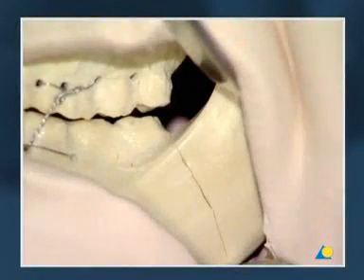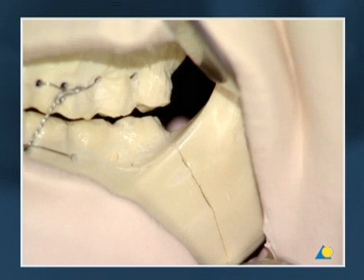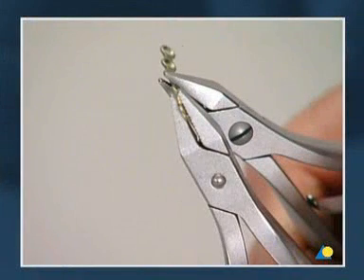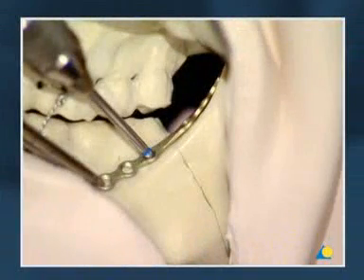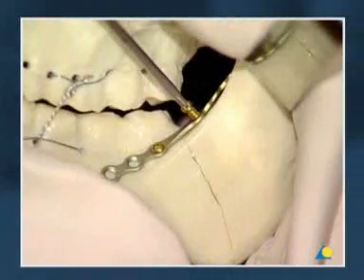Here are the main steps once again: reduction of the fracture and MMF with Ernst ligatures; adaptation of the 6-hole 2.0 mandible locking plate; adaptation of the plate and fixation of the plate to the oblique ridge.